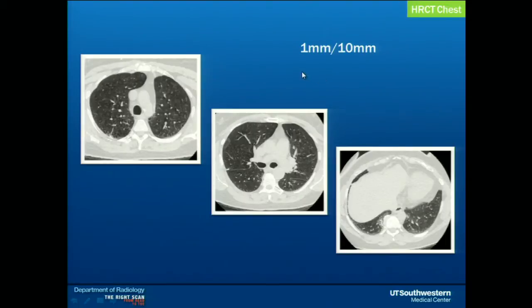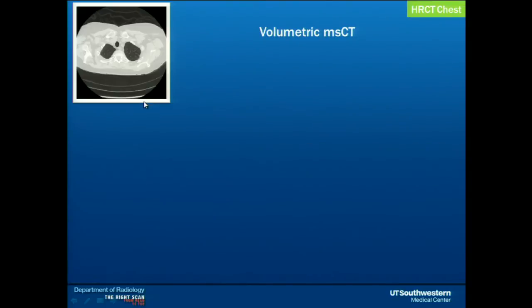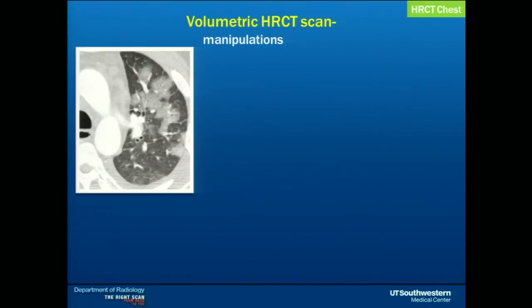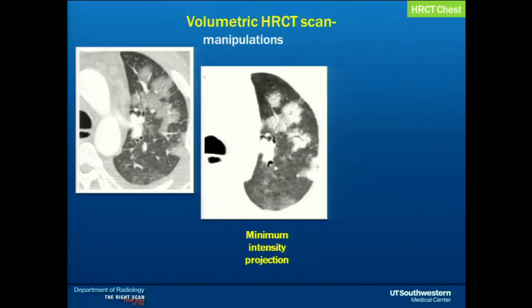This slide shows you have limited images through the lung when using a 10-millimeter interslice gap, whereas with volumetric multi-slice CT you have more lung to see. You can also do multiple manipulations. This patient had lobar pneumonia, and this is a minimum intensity projection image, which highlights pixels that are very low in attenuation, so the areas appear very dark. You can nicely see air bronchograms going into the lobar consolidations.